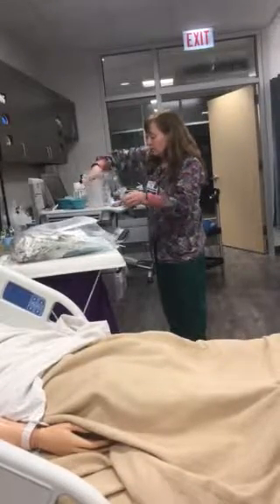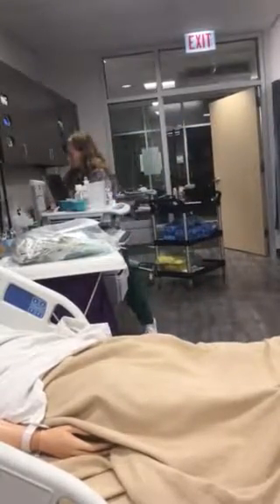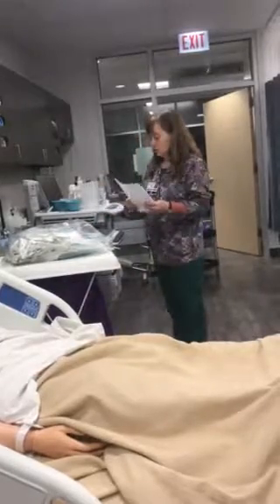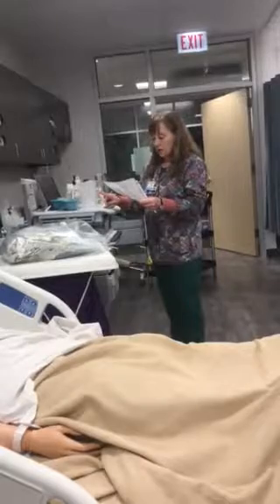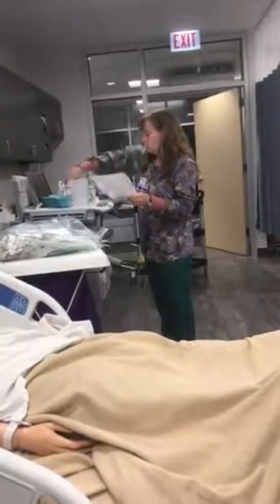I'm gonna get this stuff. And you will find out there's never enough room. Throw that away because you always clean up your area. So I'm taking my MAR. I have my Jevity, so I have MRN 62188. I have no known allergies. This is my Jevity 150 milliliter bolus.